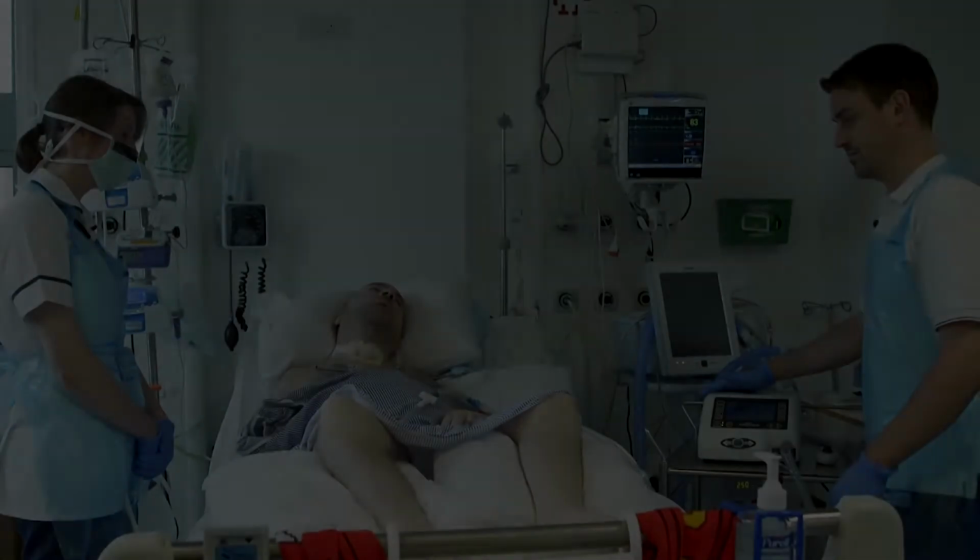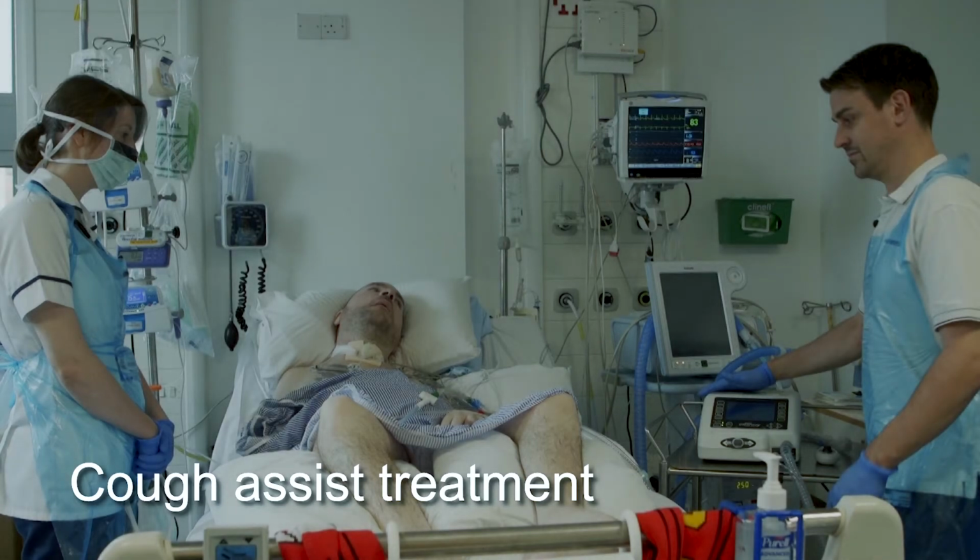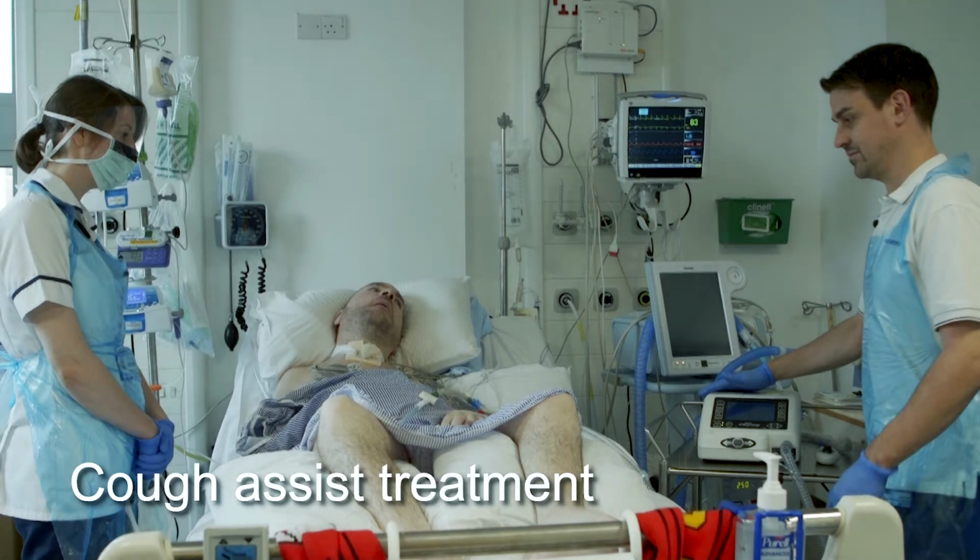In this video, we are going to see the performance of mechanical insufflation-exsufflation using a Clearway machine, a modified manual assisted cough, and closed suction via the trachea.